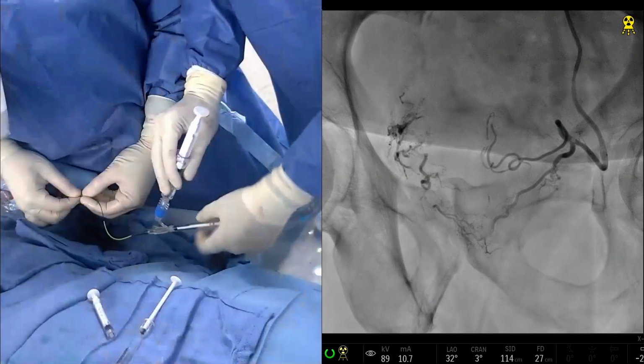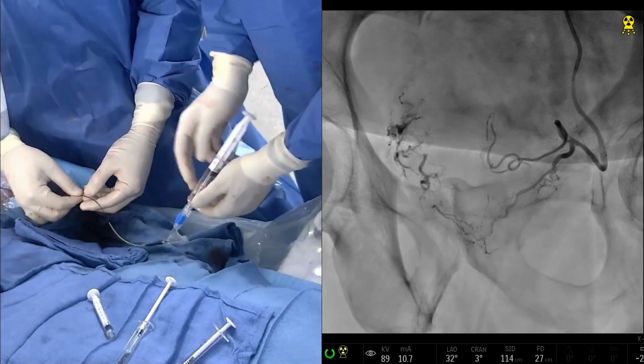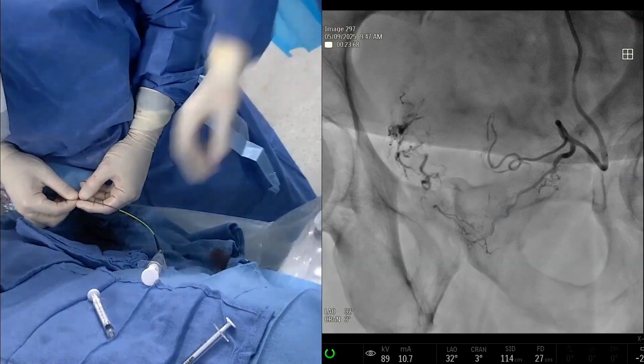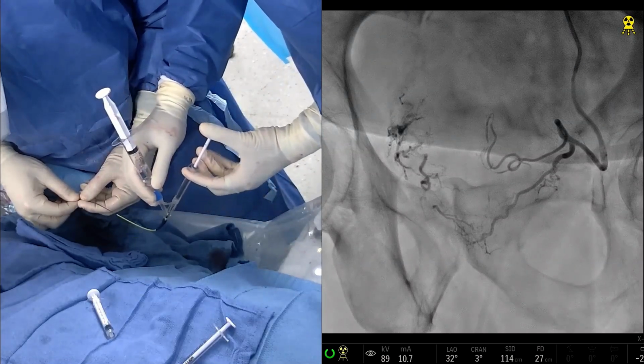And that's it. So we're basically done. We filled both of those branches. We got, as Art would say, level 3 perfusion. Maybe we can tap a little bit more in if you want. We have another syringe here just to see if we can push a little bit more in, but I don't think we need to. Do you guys think we need more penetration than that? I don't think so. So tap it. Let's just see what happens.